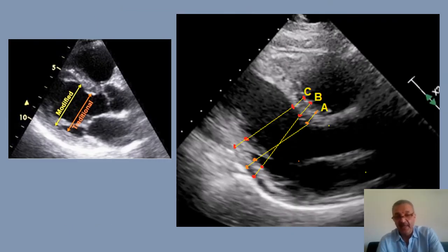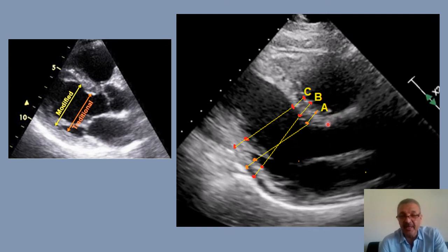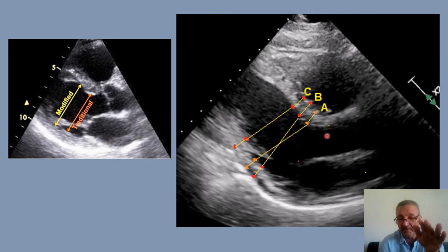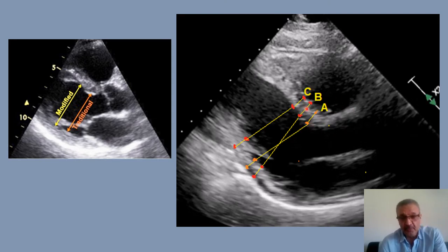Now let's see this one. Same general rules — your measurement should be perpendicular to the structure. In this patient, the heart is bent more horizontally, so the LV appears slightly oblique. You can see many of these cases in short people with a big belly, where the aorto-ventricular angle is very tight. Again, same rules: measurement must be perpendicular. Among the three shown, only one perpendicular measurement is correct; the oblique one is overestimating.